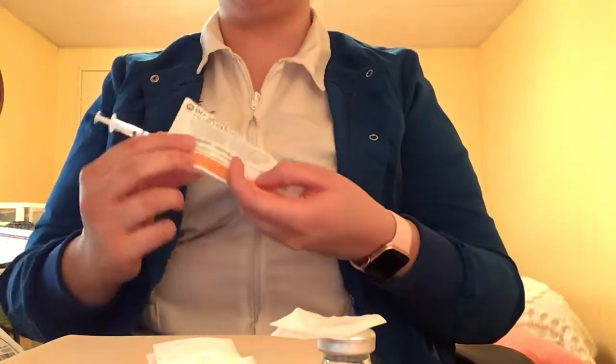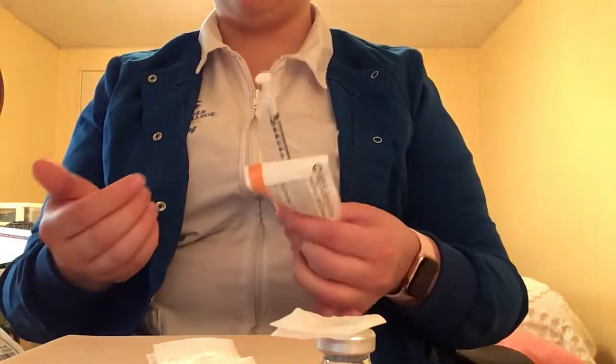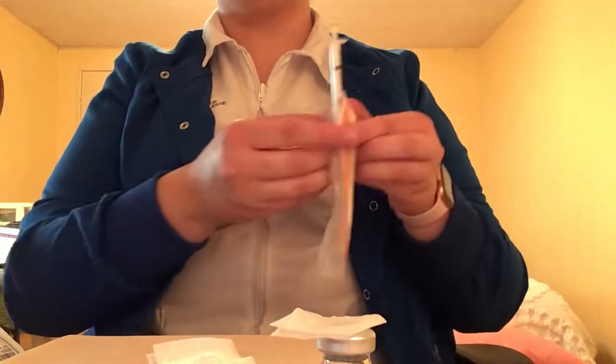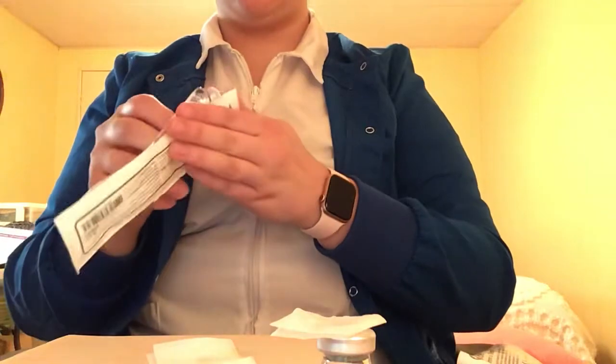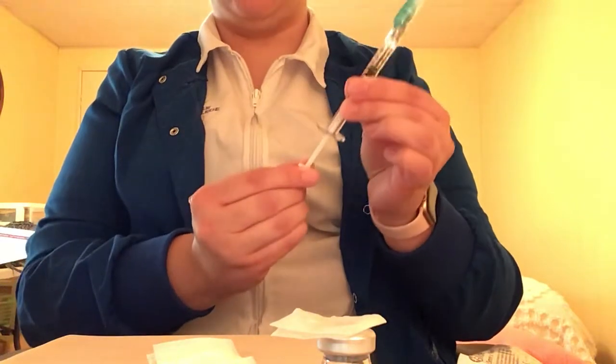And I'm going to be using a 5/8 inch 25 gauge needle for my subcutaneous injection. Now normally these would be in the sterile packaging, but for our purposes, I'm going to open up our packages both here. And if these were brand new syringes, I would want to take them out and play with the plunger a little bit just to loosen it up.